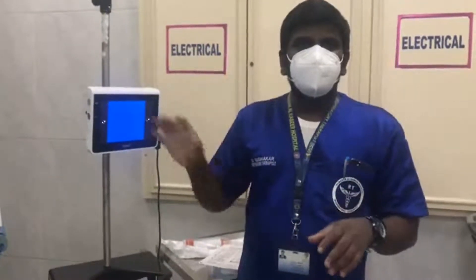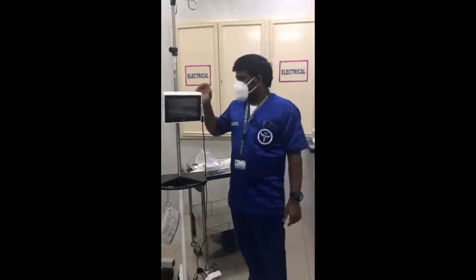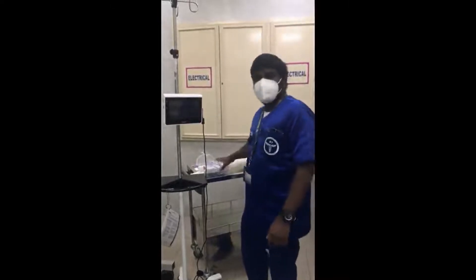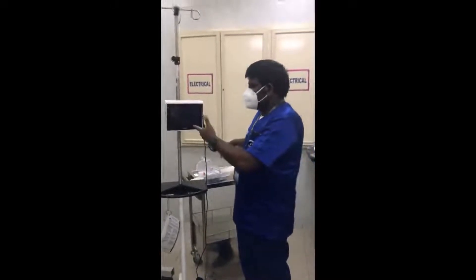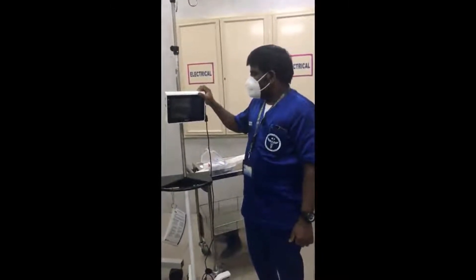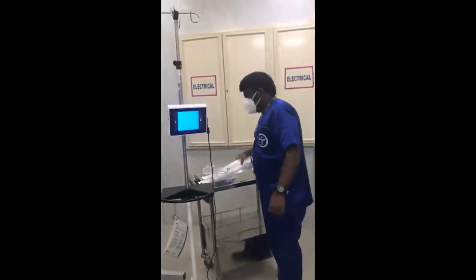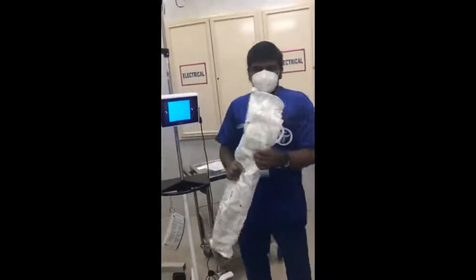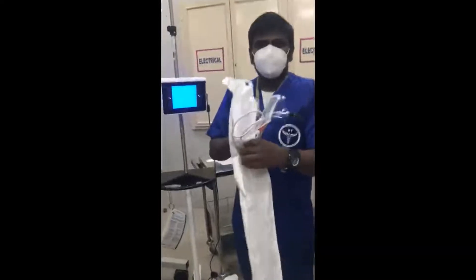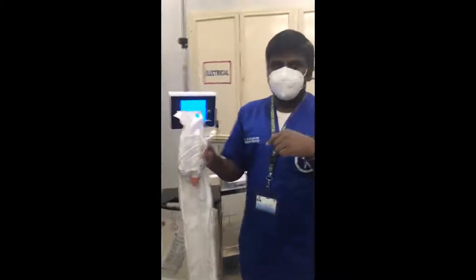Especially in the COVID scenario we are using more of this. I'm going to teach you how to connect the AMBU bronchoscope disposable to the monitor and how to use it. Just turn on the monitor screen - press here and automatically the monitor will turn on. This is the disposable AMBU bronchoscope, size 5.8. There is a 2.8 size also available - that is for pediatric size.